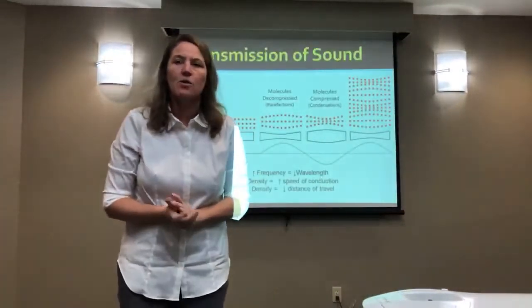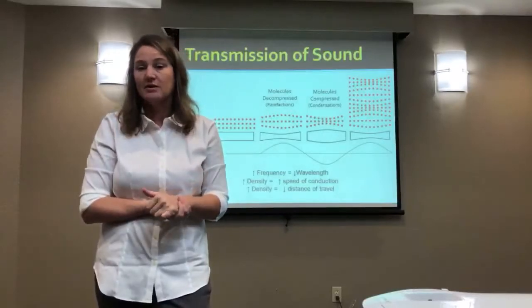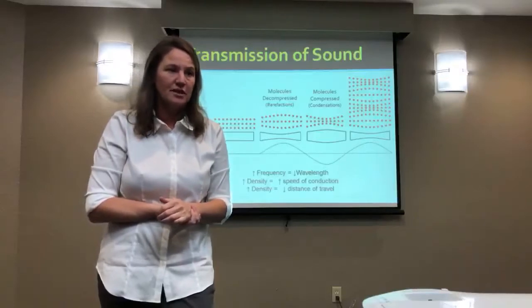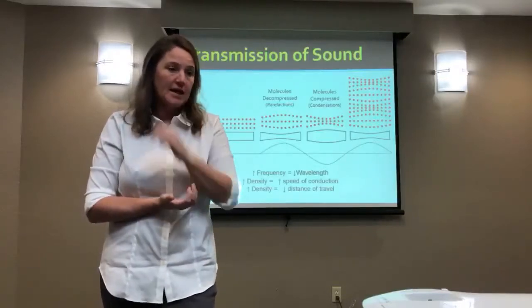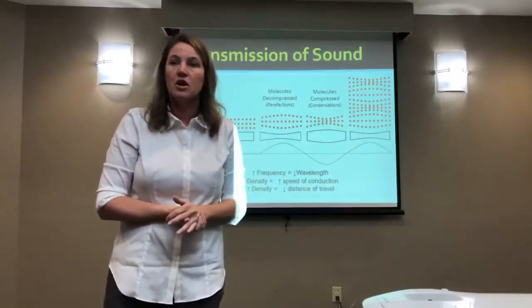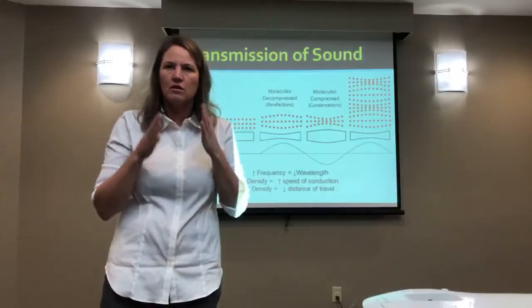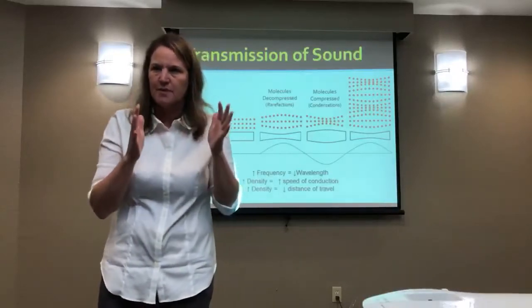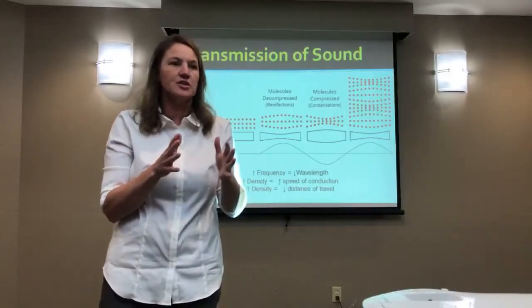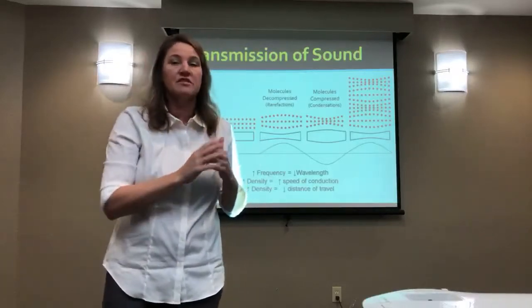So think about how it's transmitted. One of the ways that I think of, using an analogy, is similar to the sound that you're hearing anyway. It's basically the same energy. It's just simply a vibration. At a college level, when I was taught ultrasound, it didn't really make sense to me. I do remember thinking more along the lines of ray beams or laser type of things. What I didn't fully understand is that ultrasound is just a vibration. That's all it is. It causes molecules to vibrate.